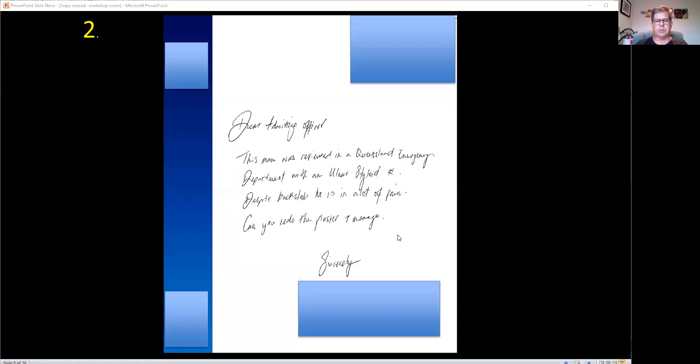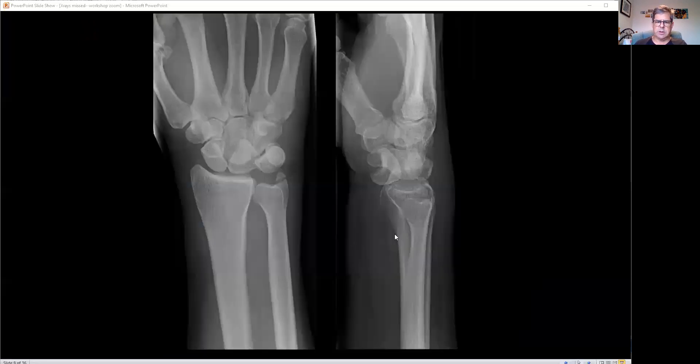Number two. Dear admitting officer — that's probably going to be you. This man was reviewed in a Queensland emergency department with an ulnar styloid fracture. Despite a back slab, he's in a lot of pain. Could you redo the plaster and arrange follow-up? So let's have a look at the x-ray. There is the ulnar avulsion styloid fracture. But this is the AP and this is the lateral.